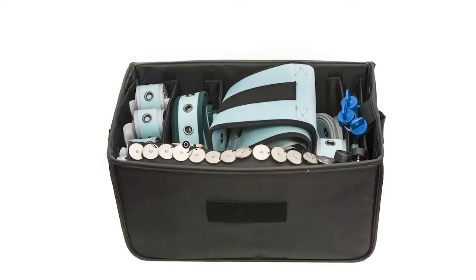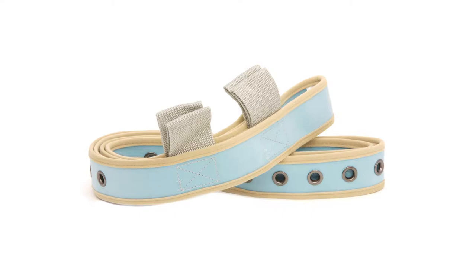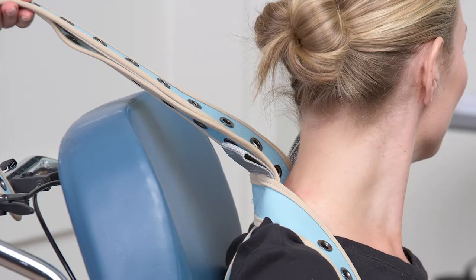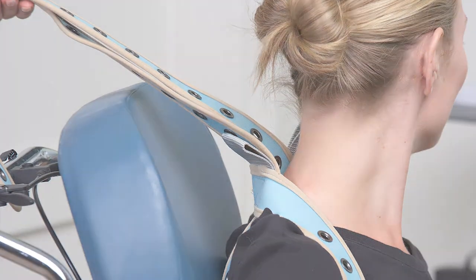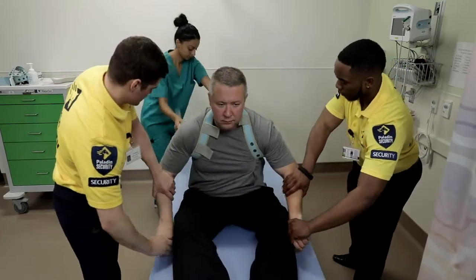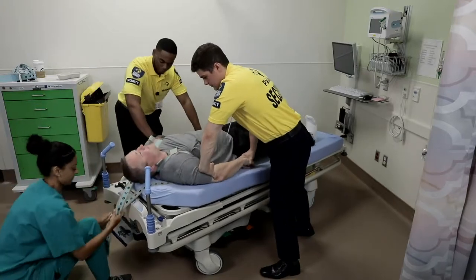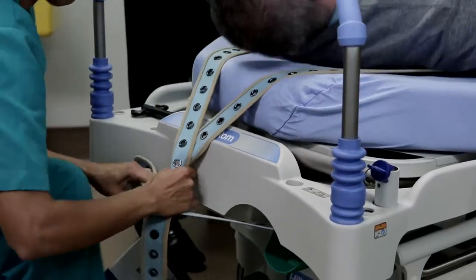The second pocket also contains the brown line belt, previously called either the torso control belt or the bed strap. We now refer to it as the large utility belt. The large utility belt is used to control the upper torso of an aggressive patient to ensure the safety of staff from headbutts, bites, or rotational punches.